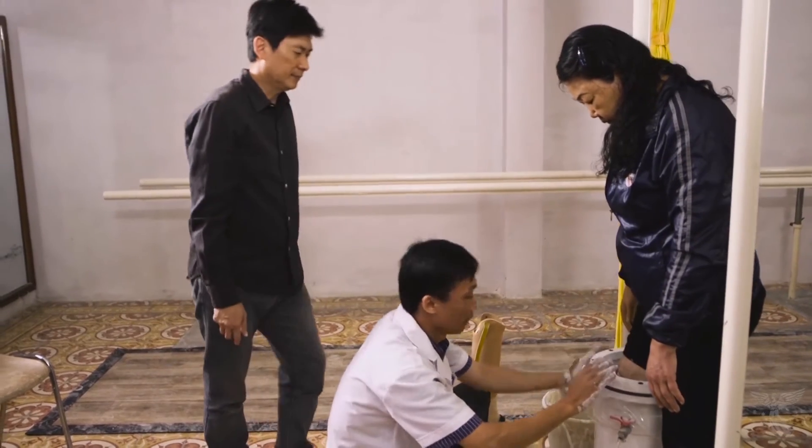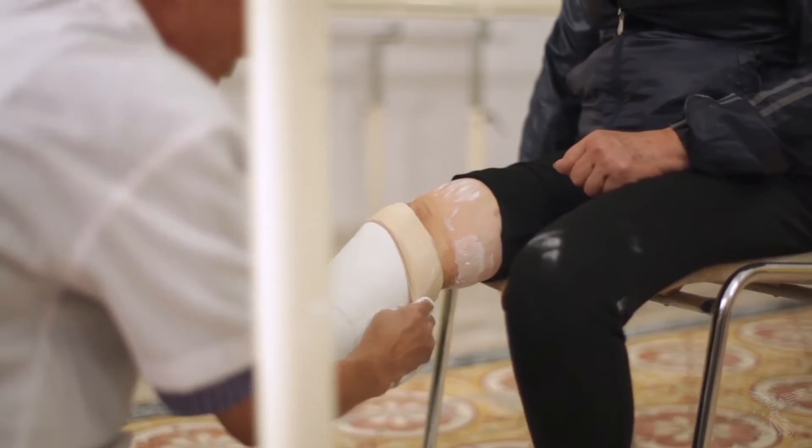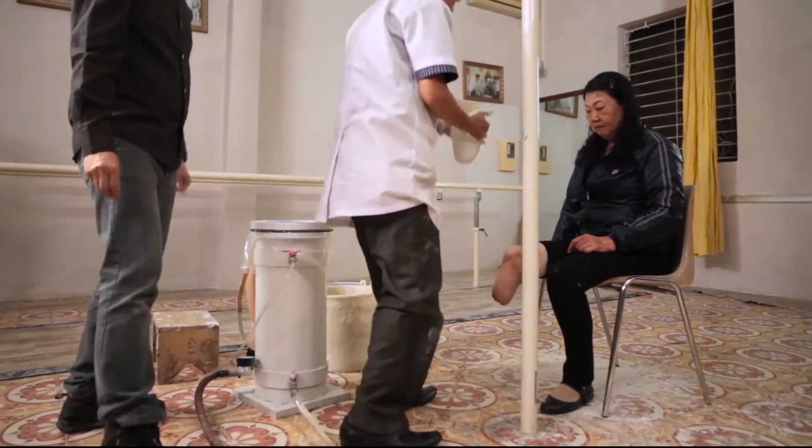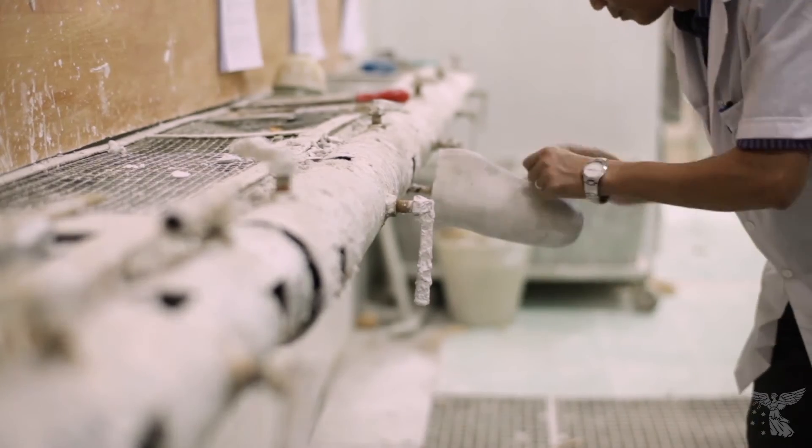The water pressure also allows them to form the cast in a load-bearing manner, which is similar to when they're standing or walking. Using this negative cast, we create a positive mould.